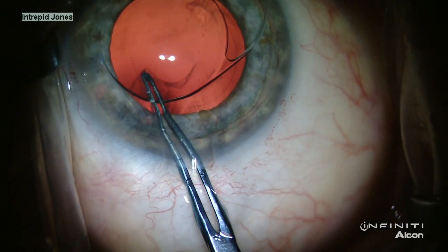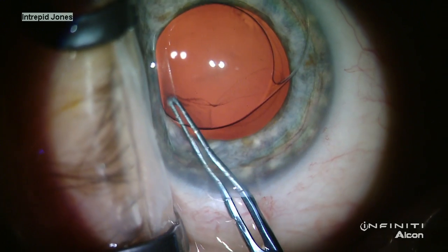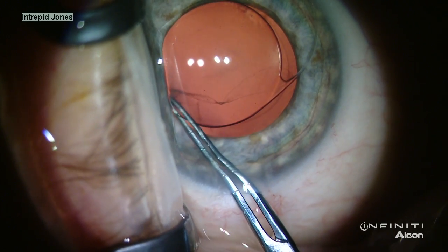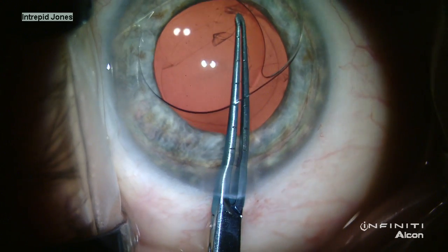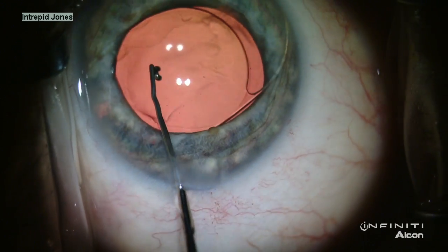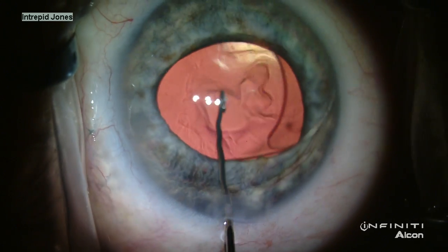Now as the patient has moved some during this surgery, some additional viscoelastic helps to gain more control of the direction of the tear at this point. Now that I have a larger, complete capsulotomy, the lens is rotated out of the anterior chamber and into the capsular bag.